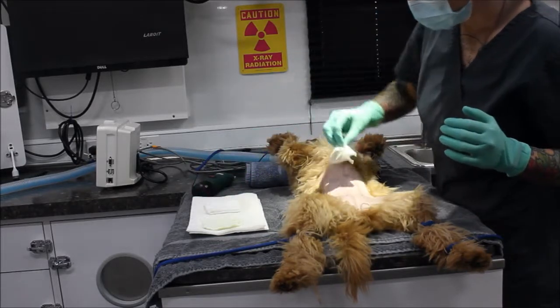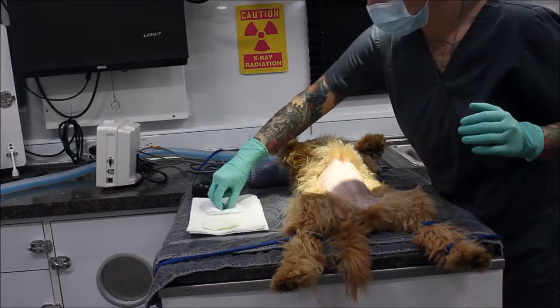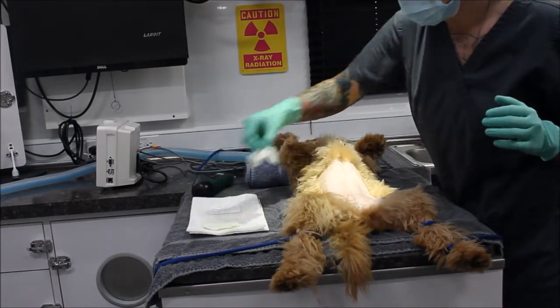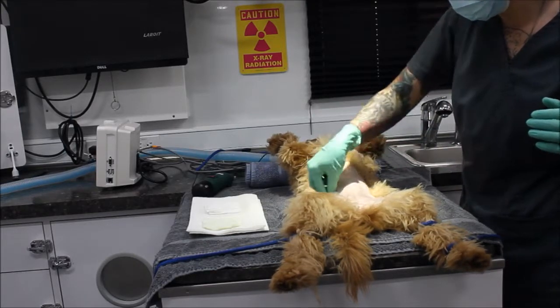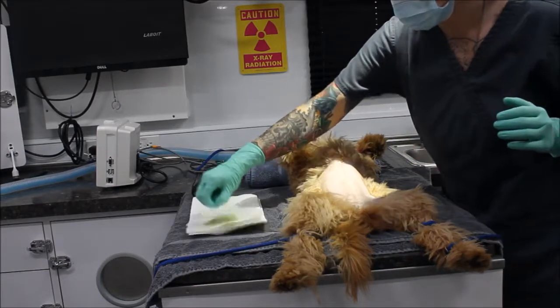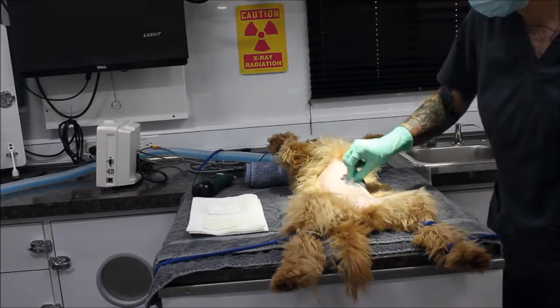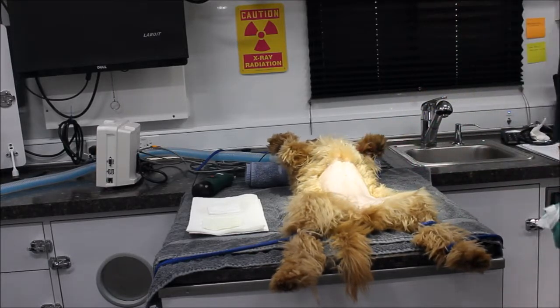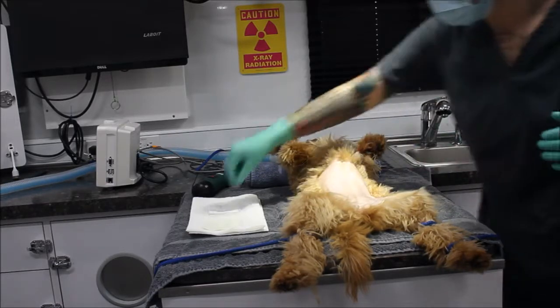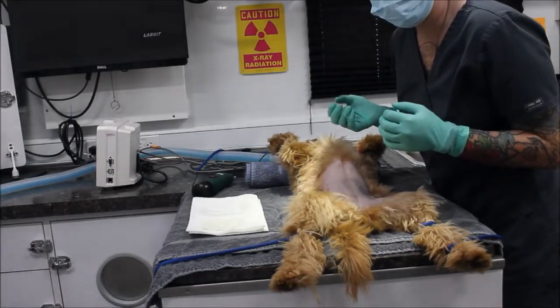I'm going to go ahead and start at the incision site and just move outwards in a target pattern. As soon as I touch the edge, I'm going to throw that away. I'll do the same with my alcohol, making sure that I don't cross back over into the incision site area. Now I'm just going to take a look at my sponges and go ahead and do one more. Now that I've finished that, I'm going to move her into the OR to do her final scrub.